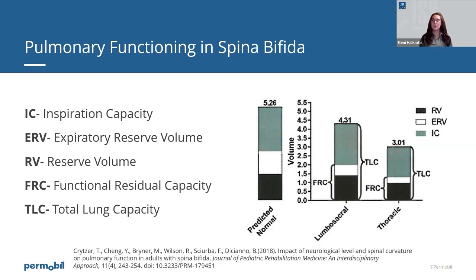But just because the client might not be complaining about it, or to them it might seem normal, or to an OT or PT, where many of us do not have this specialization, I mean, we're not respiratory therapists, they might seem to be doing all right. We still want to make sure that our interventions with configuring wheeled mobility systems that they're going to be sitting in day in and day out can optimize their pulmonary function.